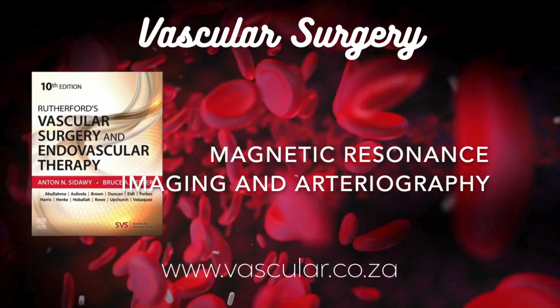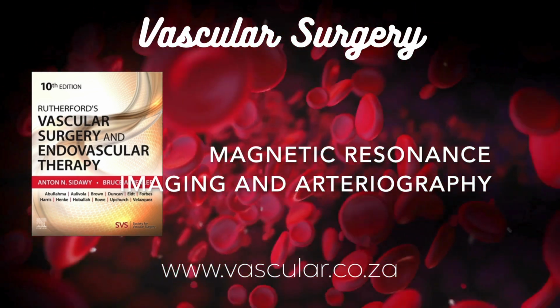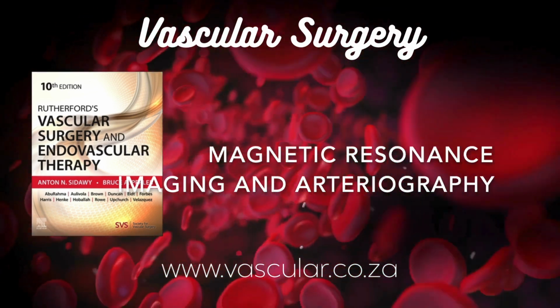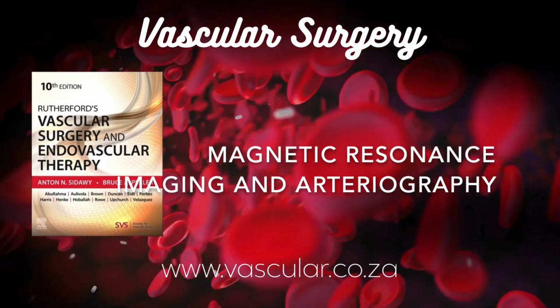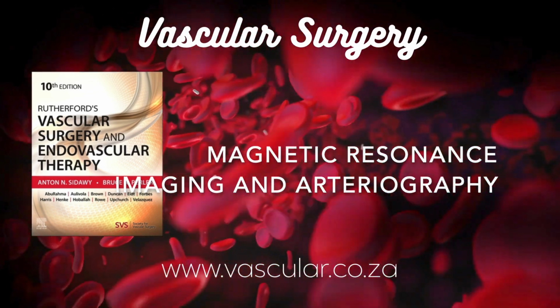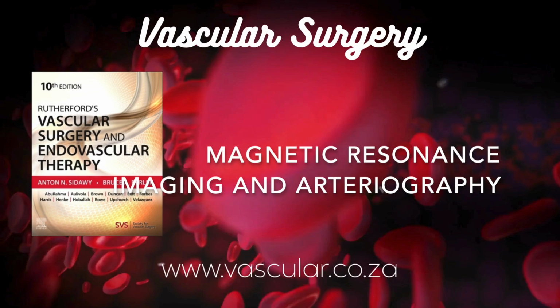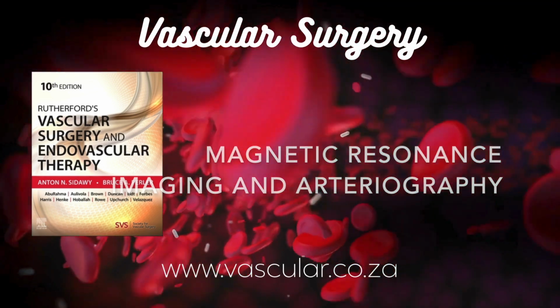It's quite clever, actually. TOF angiography uses a fast T1 weighted sequence. Now imagine you're repeatedly sending RF pulses into a slice of tissue. The stationary tissue within that slice keeps getting hit by these pulses, and its signal becomes saturated, meaning it gets weaker and looks dark on the image. But the blood flowing into that slice from outside hasn't seen those repeated pulses yet. Its protons are fully magnetized. So when that fresh blood flows in, it gives off a much brighter signal compared to the suppressed background tissue. So flow, in effect, makes the blood bright. Exactly. Flowing blood appears bright against a dark background of static tissues. It's called flow-related enhancement. Neat.